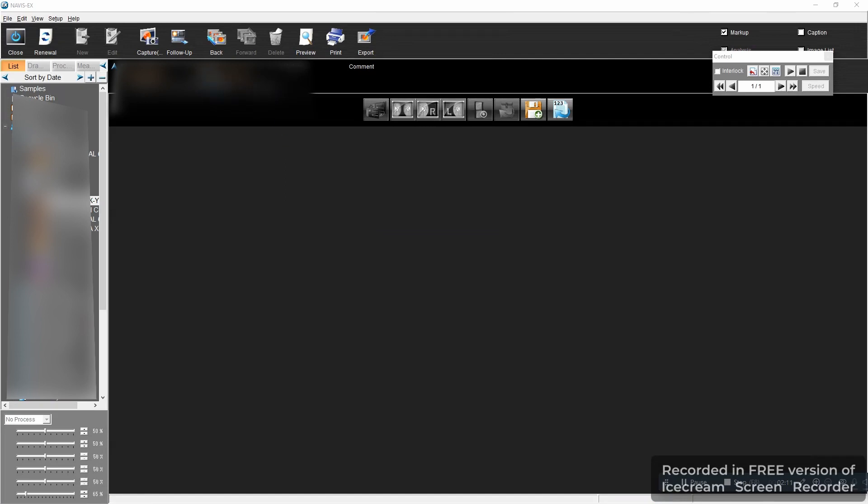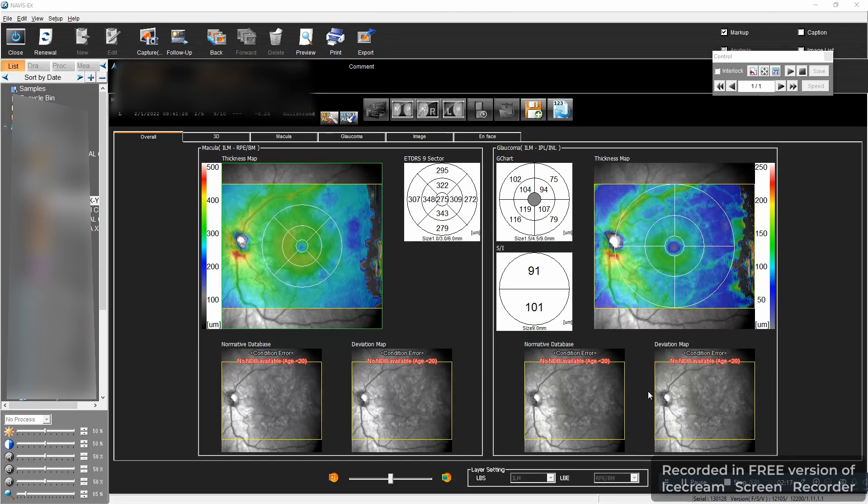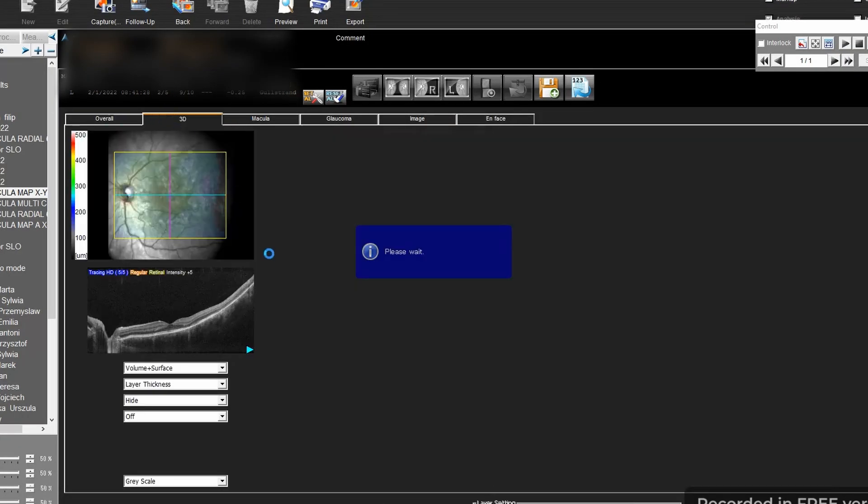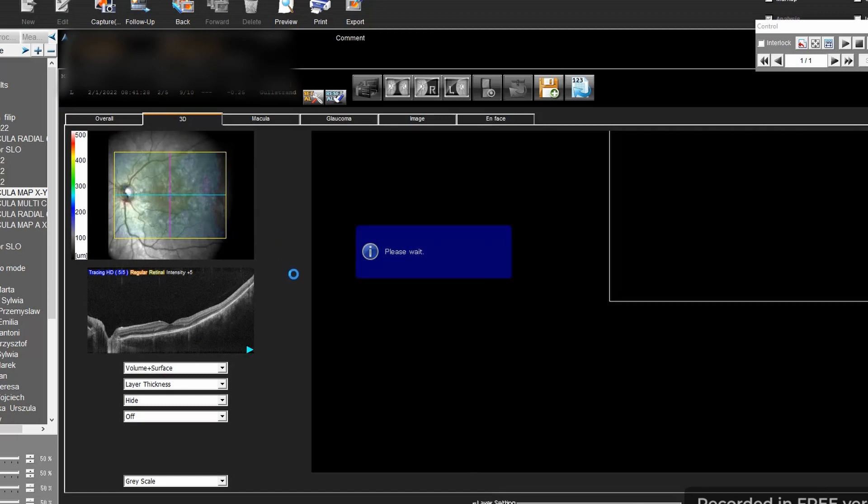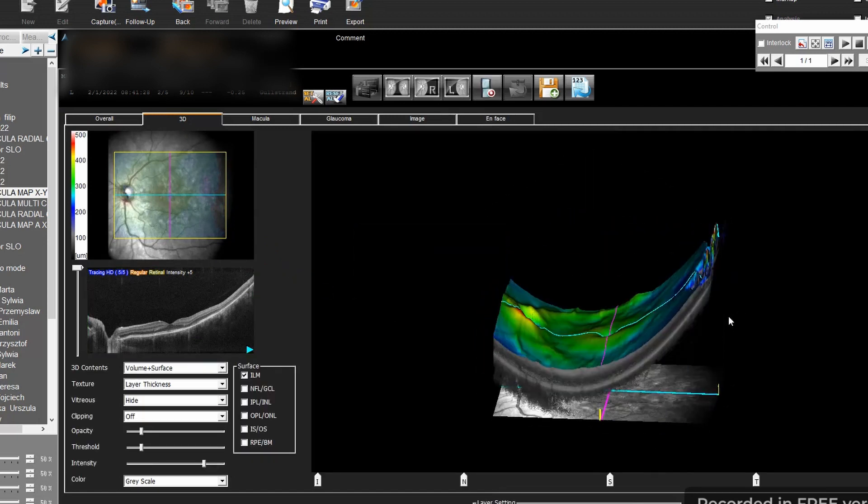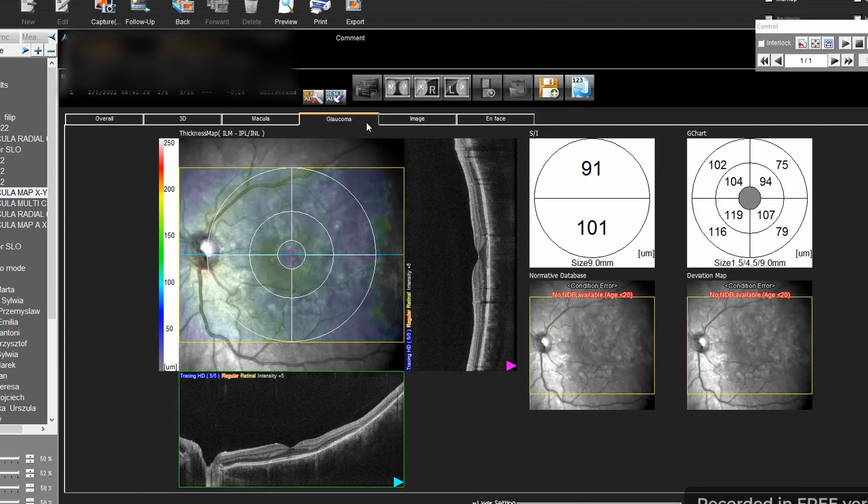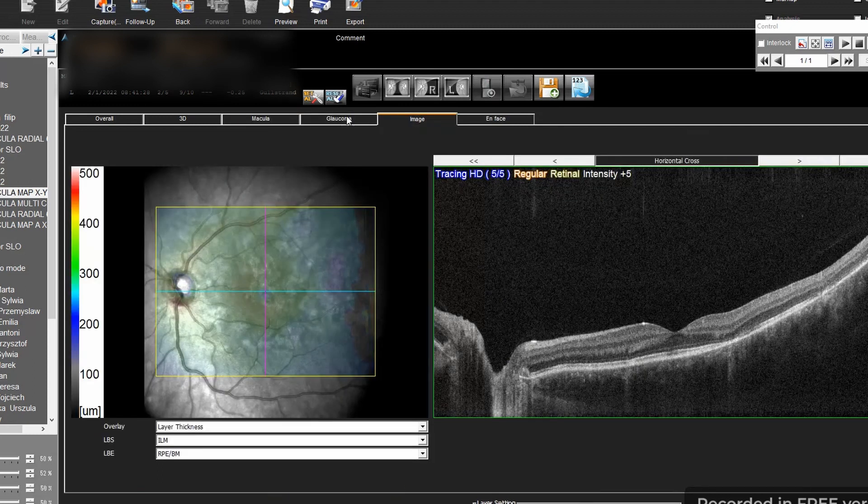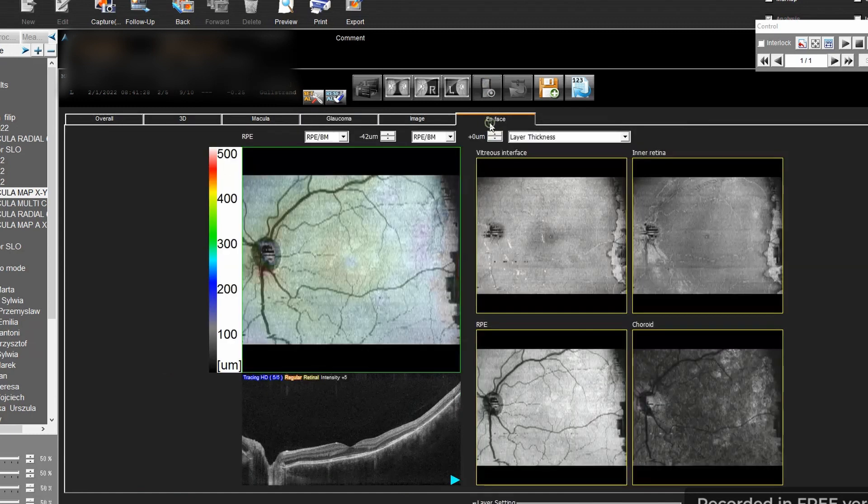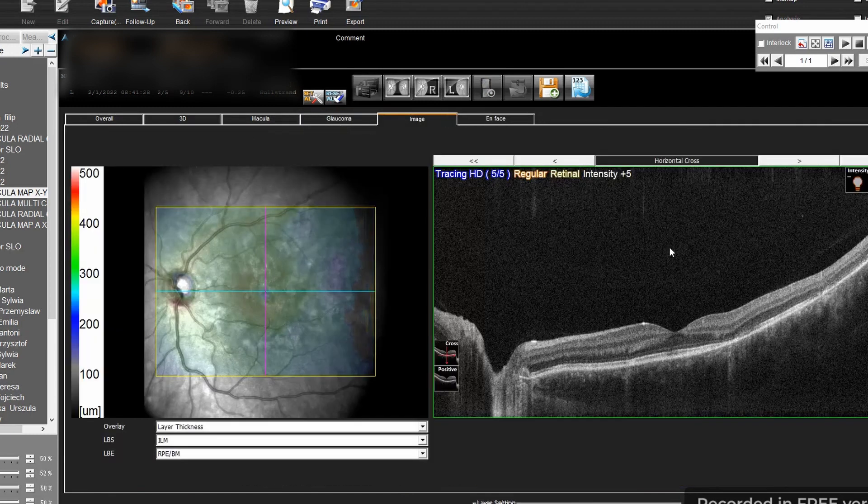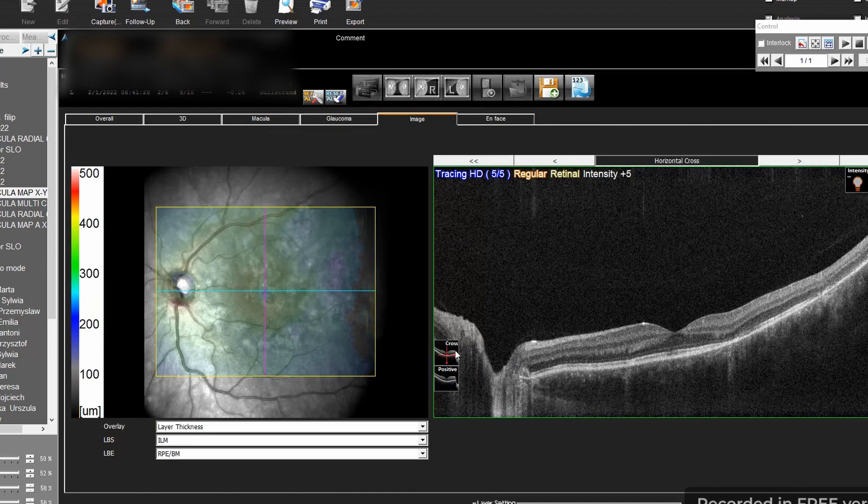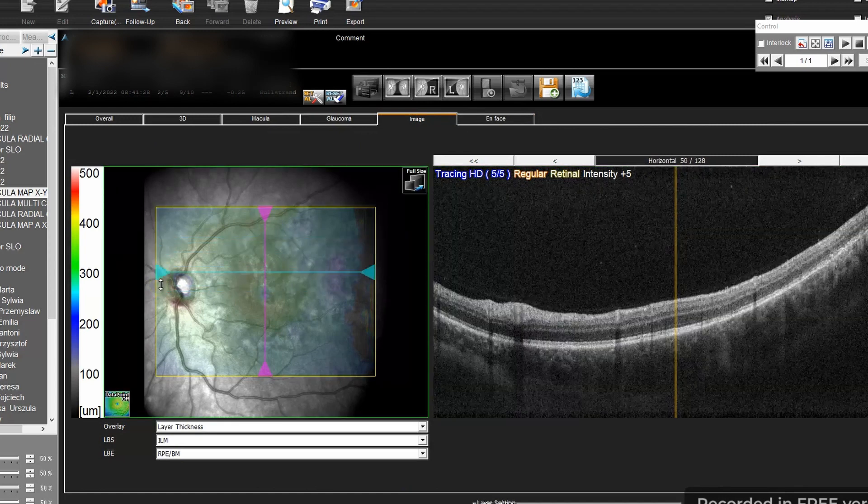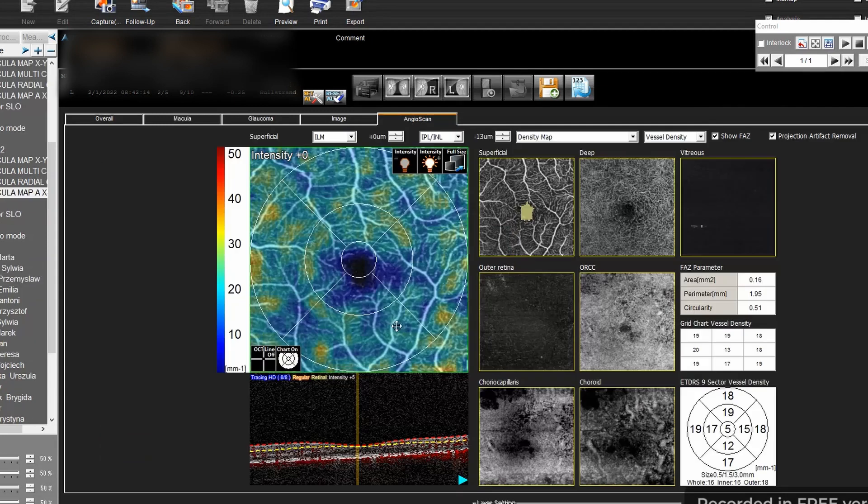Here we are going to see the color coded thickness map of the retina and this is basically 12 millimeters by 9 millimeters. It's pretty wide. This is the 3D animation. Then you have the macula mode, glaucoma mode image. The image even on the 3D scan still looks very good. The resolution is still very good, you see the end of the choroid despite this being more or less a screening image.